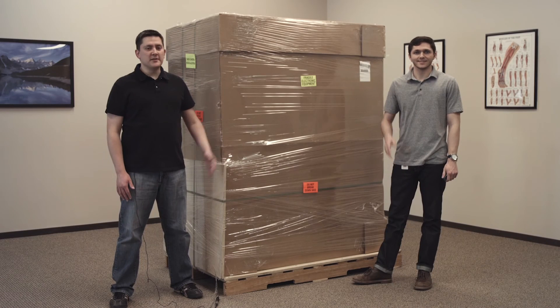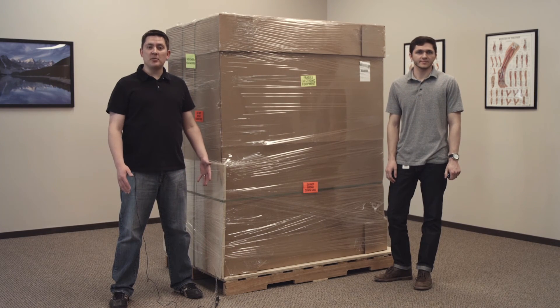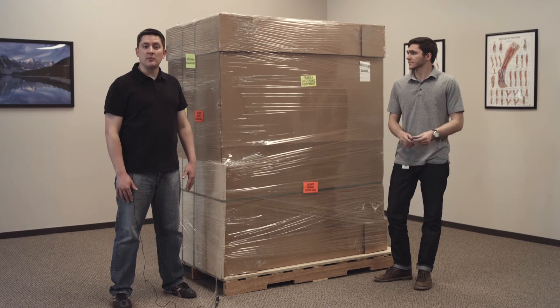Hi, my name is Michael and this is Brennan and we're with Bioness. We're going to show you today in this setup and unboxing video how to set up your Bioness Integrated Therapy System.